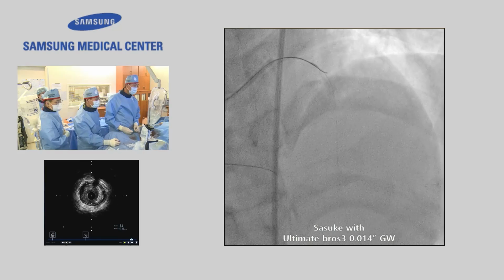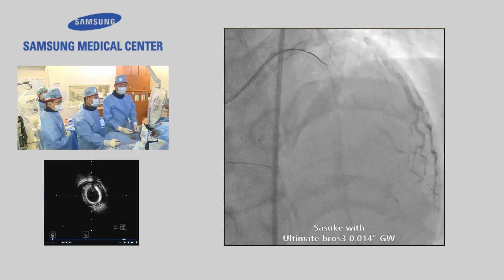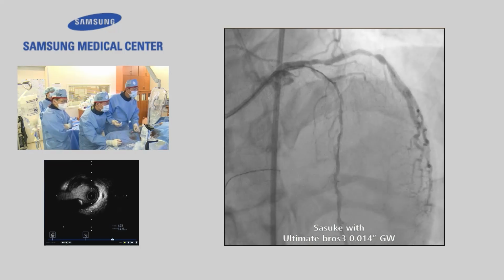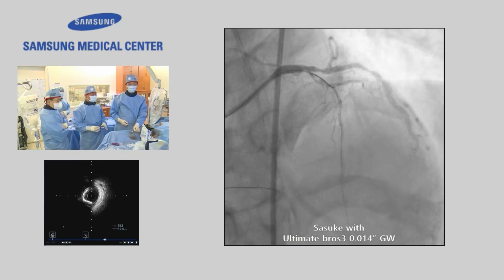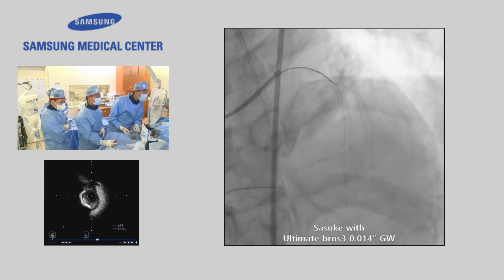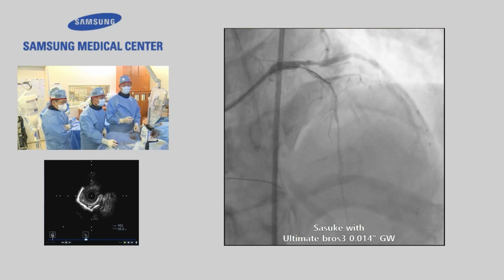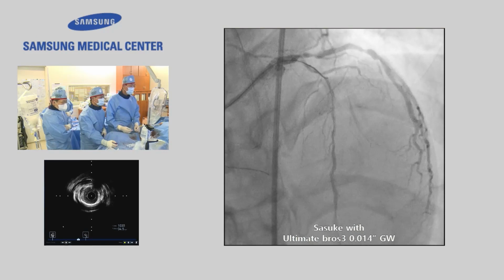So you choose the UB3 for penetration of the ostium? Actually, I'm not sure. We need a discussion about that. Andrew? Sure. So, Dr. Han, you have something to say about the wire change. I prefer a Gaia Second. What do you prefer? This is a little bit proximal position of the plaque, right? But I would like to try here.